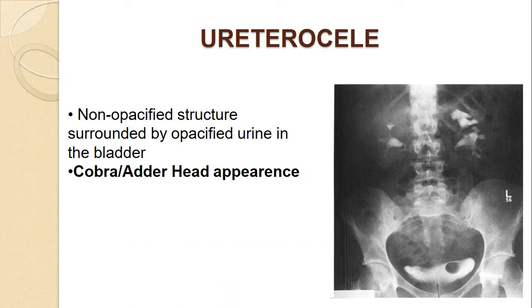Contrast I can appreciate in the urinary bladder, but on the left side it's more prominent, and on the left side near the VUJ, there is a filling defect.